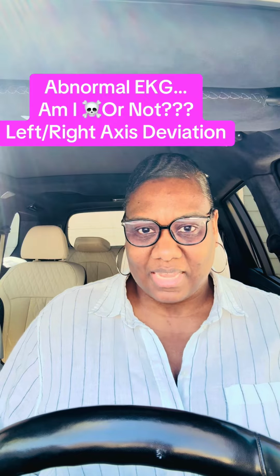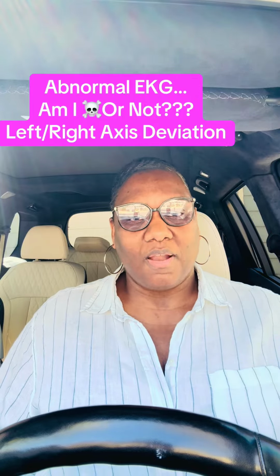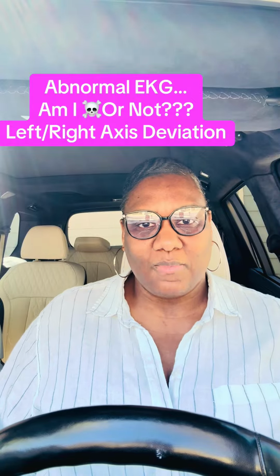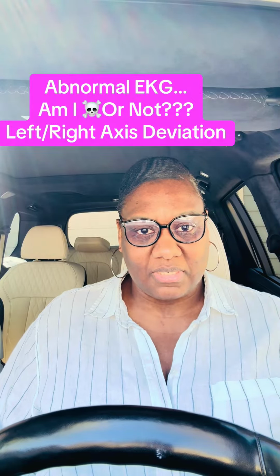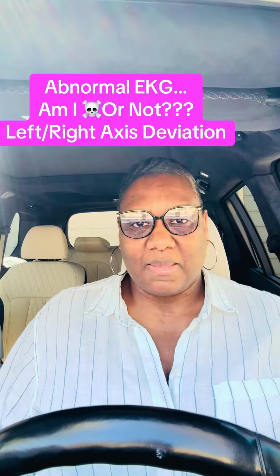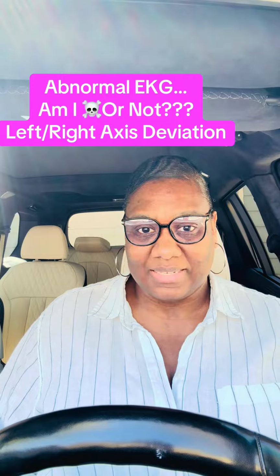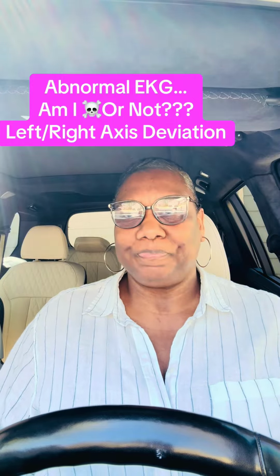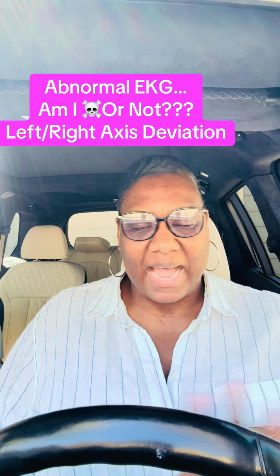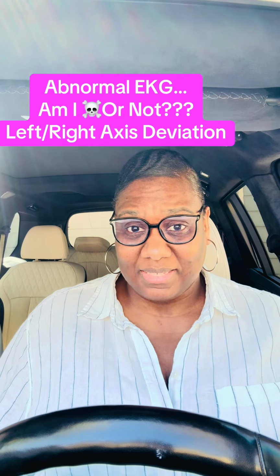The EKG tells us what the heart is doing electrically on paper. The echocardiogram gives us actual eyes on the heart to see what the heart's chamber dimensions are, to see how well the heart squeezes and relaxes, to see the musculature of the heart, and of course the valvular integrity on the inside. So wrapping things up, left or right axis deviation by itself in the absence of symptoms means you need to repeat this EKG.